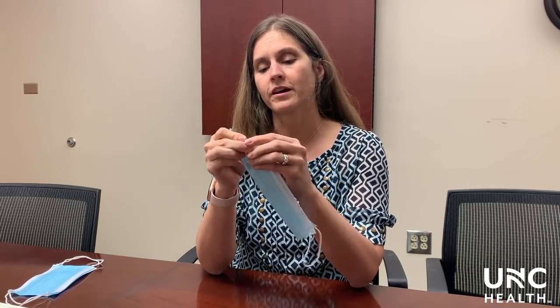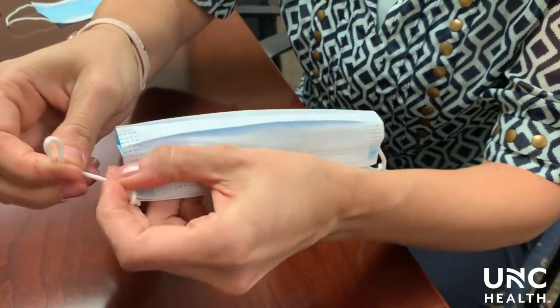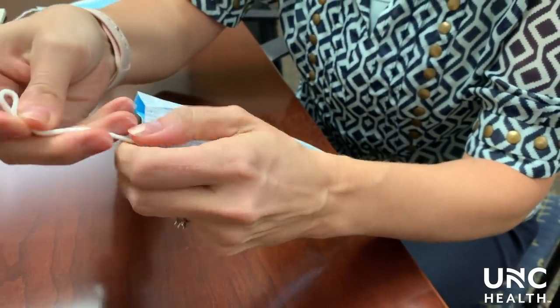Take your mask and fold it edge to edge, then in one hand take the ear loop piece and knot it, making sure to get the knot as close as possible to the mask itself.